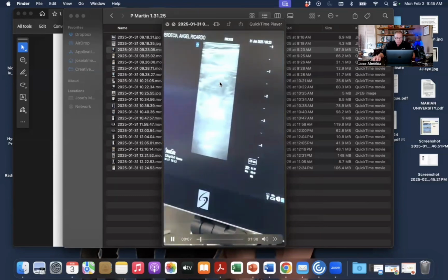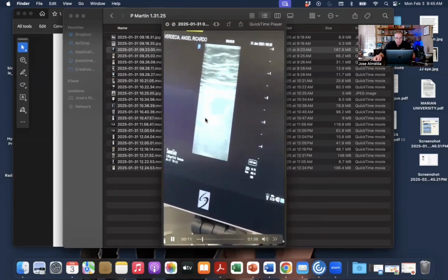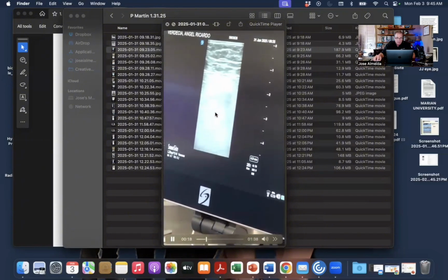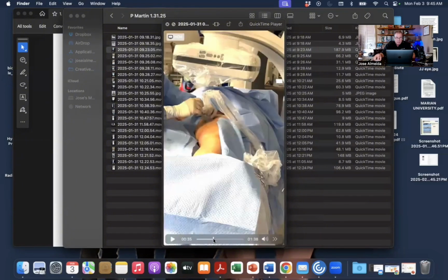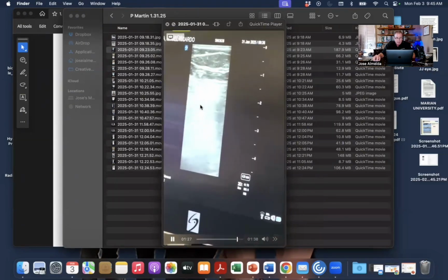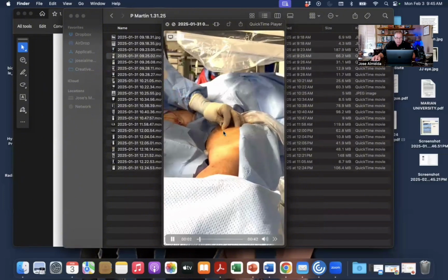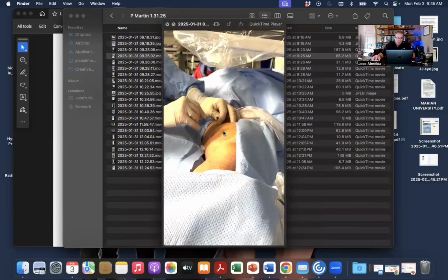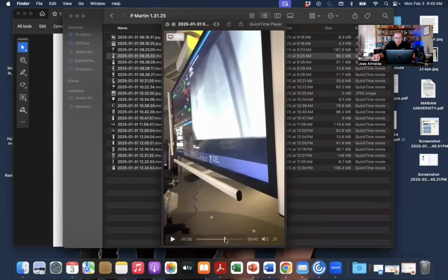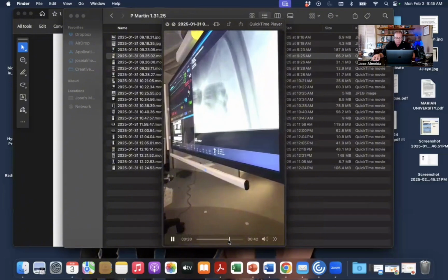This is the common femoral artery, occluded femoral vein below, completely occluded on the left with pretty much no inflow. That's me compressing the artery, trying to find a vein, and eventually I stuck the occluded femoral vein. It's me navigating the needle to behind the artery and was able to get in the occluded vein. And usually we can find a little channel of flow, able to thread a wire. We use fluoro to guide us. So it's a combination of ultrasound and fluoro.